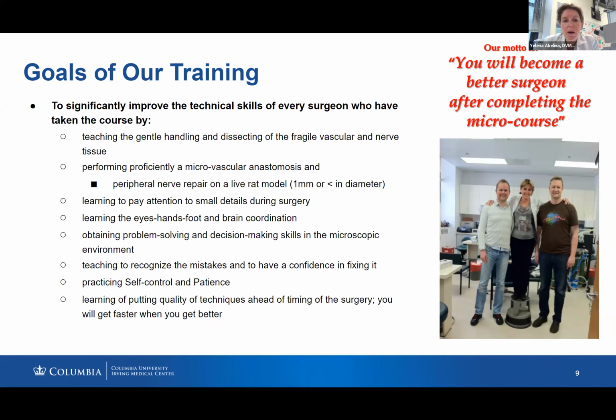And I also get people to understand that quality of technique is more important than the timing of the surgery. You will get faster if you get comfortable. So learning microsurgery usually goes slowly and then speed will increase.